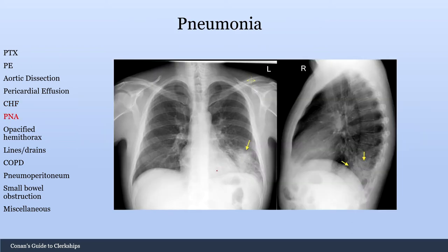Now let's move on to pneumonia. The most important thing is identifying the location of the pneumonia. You can see this consolidation here, but you need to always have a lateral X-ray to truly know the location. Here you can see this consolidation on the lateral — this is classified as a left lower lobe pneumonia.